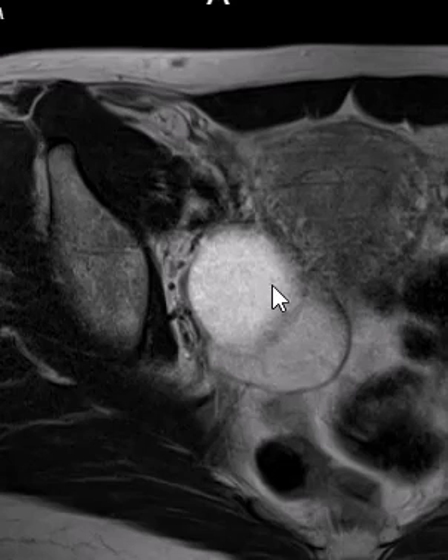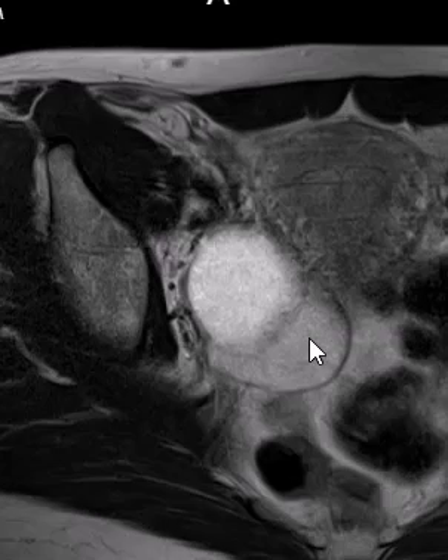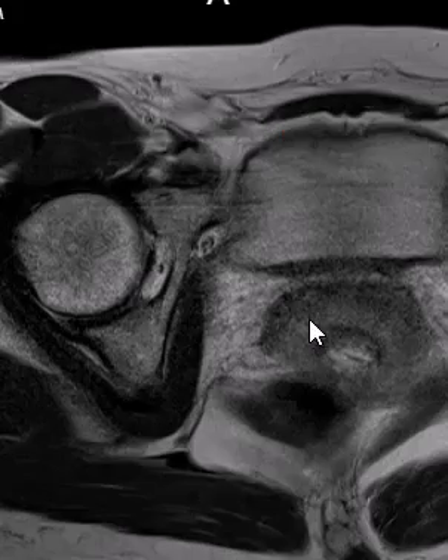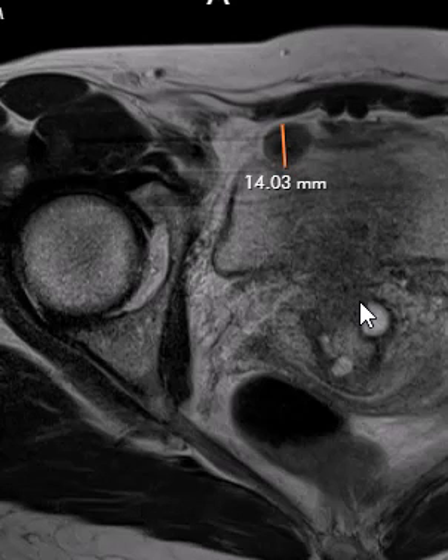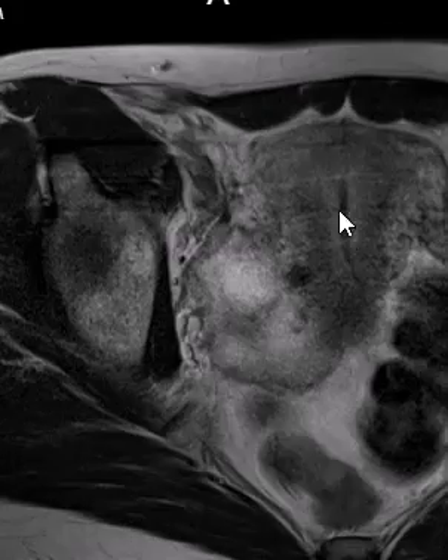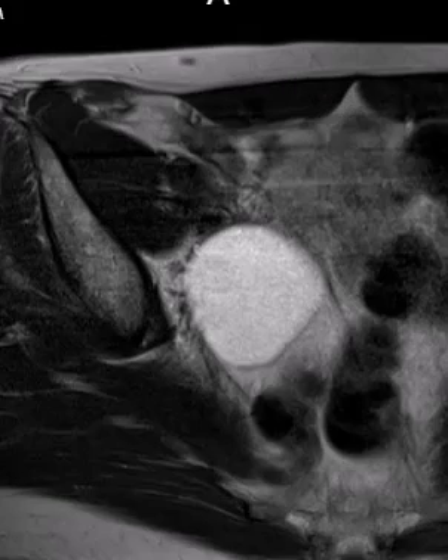At first glance these look like ovarian cysts, but when we look on the T2-weighted images, they are not quite the same signal intensity. One is more bright, and comparing to the urinary bladder below, they are brighter than the bladder. There is also a small nabothian cyst in the cervix and a small pedunculated fibroid from the uterine fundus.